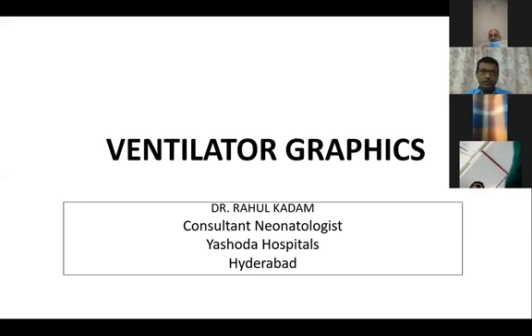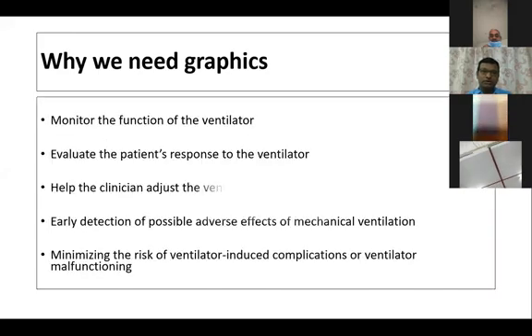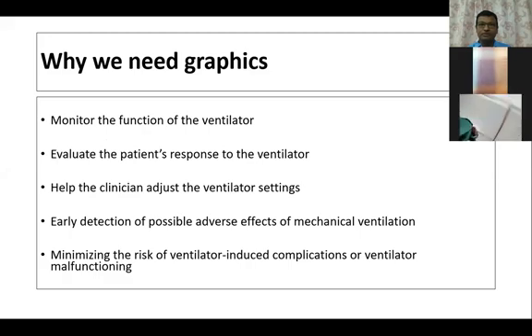So why do we need graphics? We need graphics to monitor the function of the ventilator, to evaluate the patient's response to the ventilator, to help us adjust the ventilatory settings, for early detection of possible adverse effects of mechanical ventilation, and to minimize the risk of ventilator-induced complications or any ventilator malfunctioning.